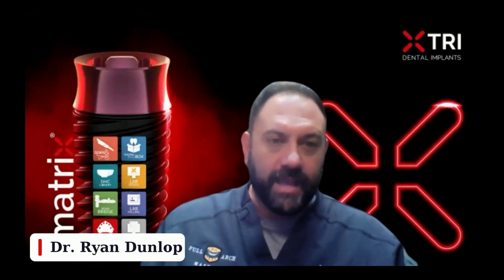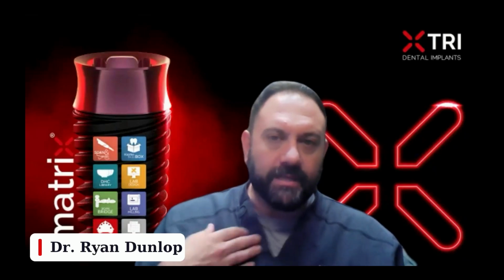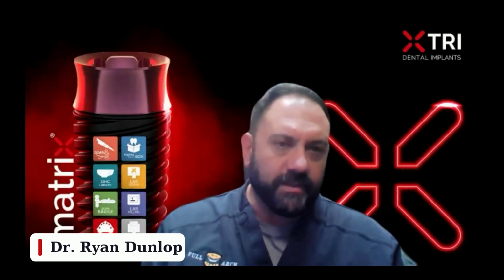I will say that the angled screwdriver is a ball driver, so that's not going to engage quite as deep, and you can have a little skipping. But again, it's so early in the process, I can't say whether or not that's going to be a huge issue. My gut feeling is no. Yeah. Thank you. Next question.